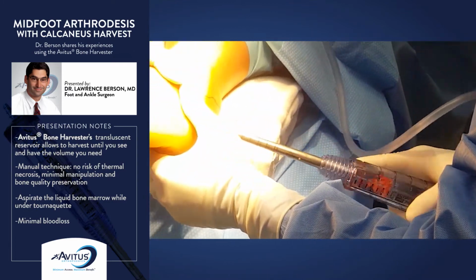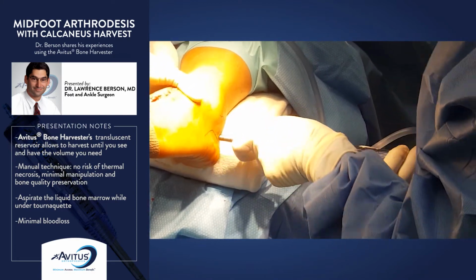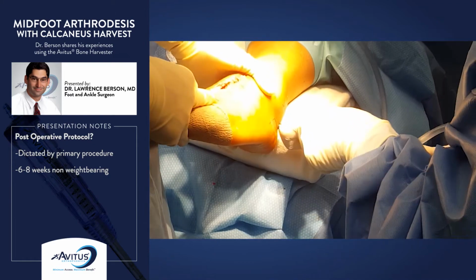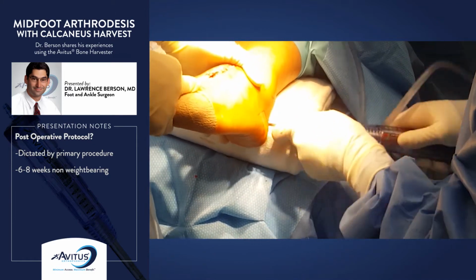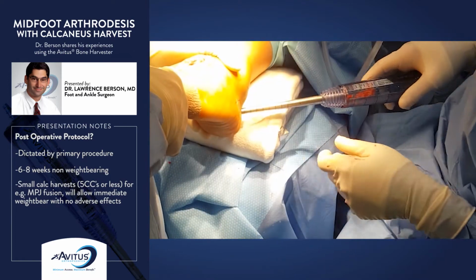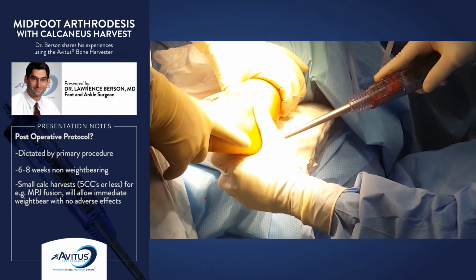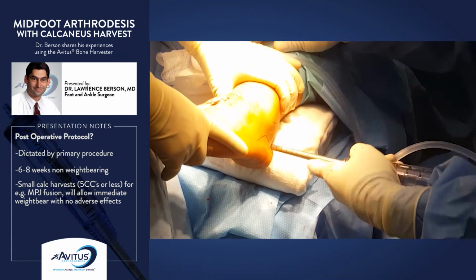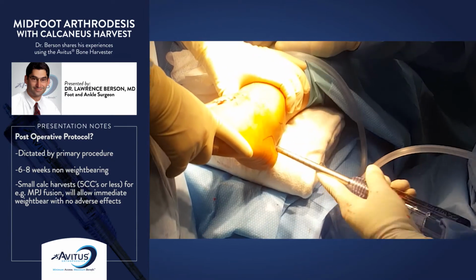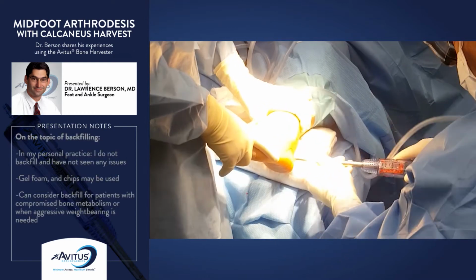These cases, generally I do under a tourniquet, so as far as intraoperative blood loss, it's minimal. My postoperative protocol is usually dictated by the primary procedure. If it's going to be an arthrodesis procedure, they're going to be non-weight bearing for 6 to 8 weeks. I will occasionally do a small bone graft for a procedure such as a toe arthrodesis, where I will let them weight bear immediately, and no adverse effects after doing that right after bone graft.